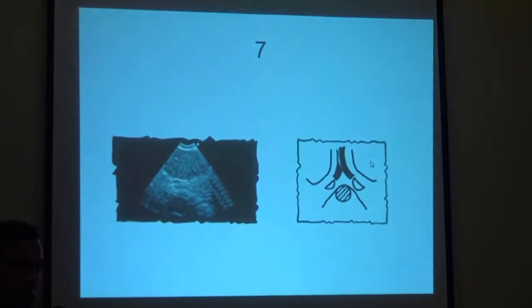Station 7 is also a station where you rely on your endoscopic view, not your ultrasound a lot. If you're seeing the cardiac pulsation, it will help you to know that this is where you are, because you see the atrium on the other side that's pulsating. I'll show you an image. Actually, you can also see it here. So that's your atrium. These are some artifacts, not very important. You can either puncture from the left or the right. If it's high subcarinal, it's equivalent. If it's low, then it will make a difference. So you can try both sides and decide from which side to puncture.